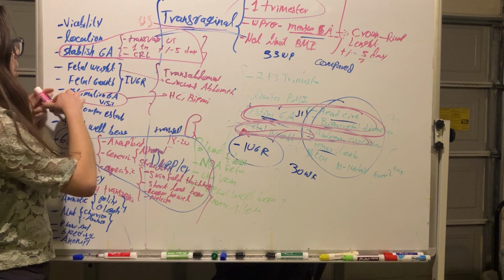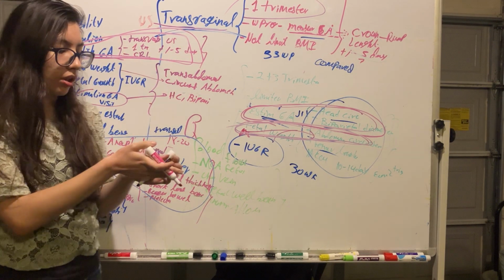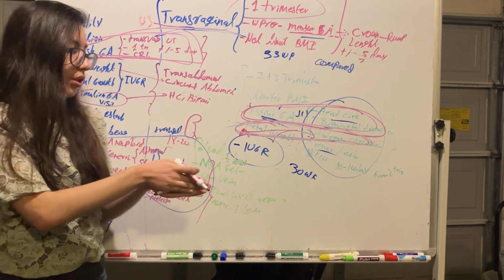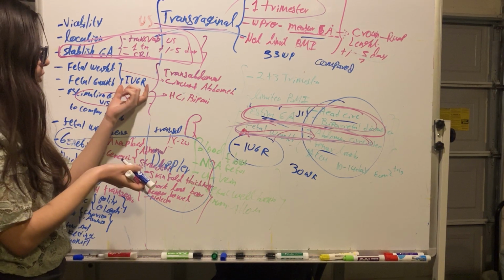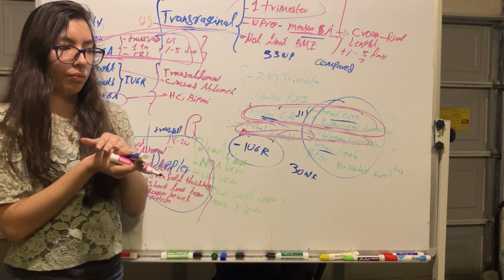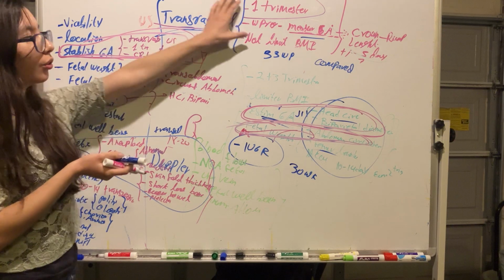Even though we have an established gestational age at this time, we always measure a new gestational age based on a new ultrasound, which now is transabdominal, to compare it and evaluate intrauterine growth restriction, even though the gestational age measure is always going to be with the established one during the first trimester.